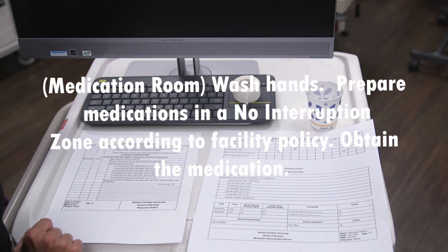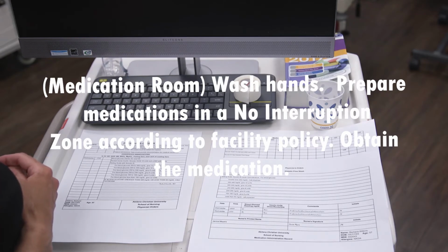Medication room. Wash hands. Prepare medications in a No Interruption Zone according to facility policy. Obtain the medication.